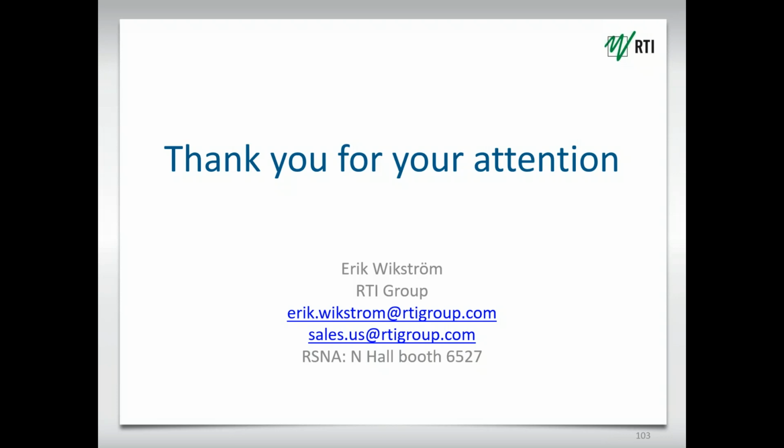I'd also say that Ocean Quick Check is license free. That comes with each and every instrument that works with Ocean, the Piranha and the KVp Flex, for instance. They all come with Ocean Quick Check. Ocean Professional is an additional license, but that's shareable. Yes.